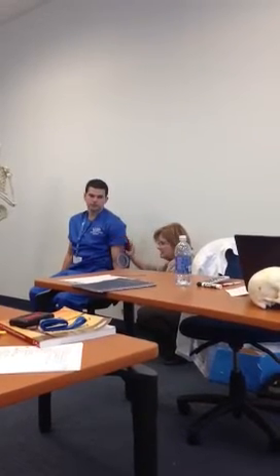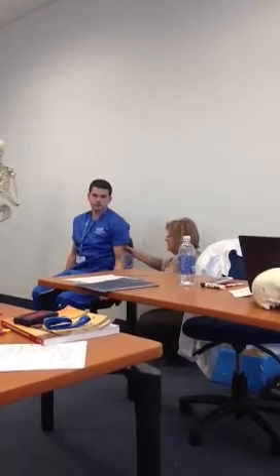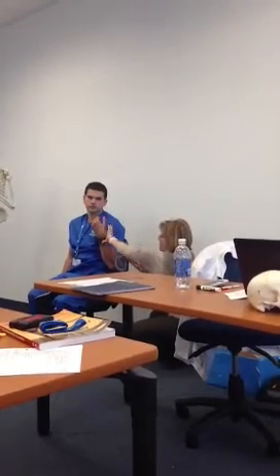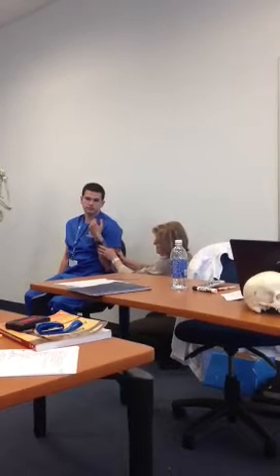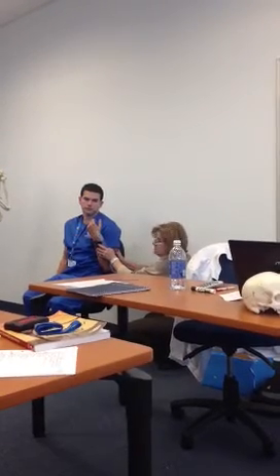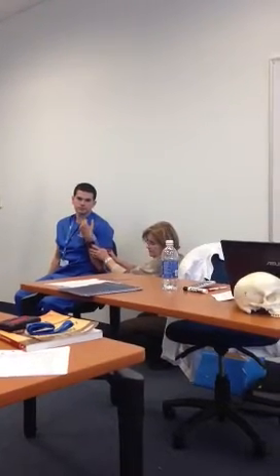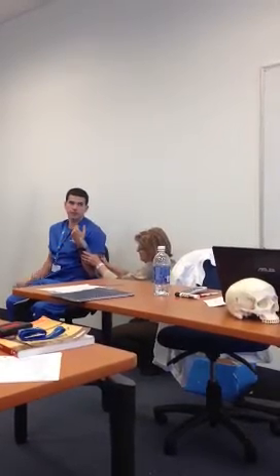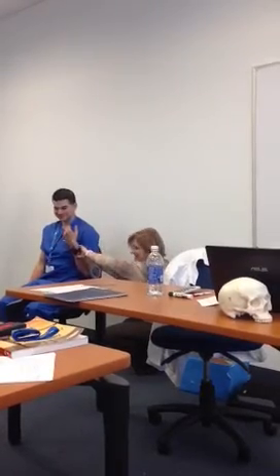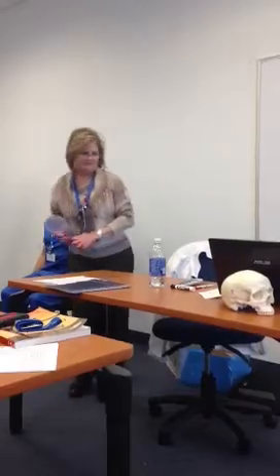Okay, so that's my 0 here. Then he has 140 degrees of elbow flexion. Okay. 140. Almost 140. Okay. Now, how do we do supination and pronation?